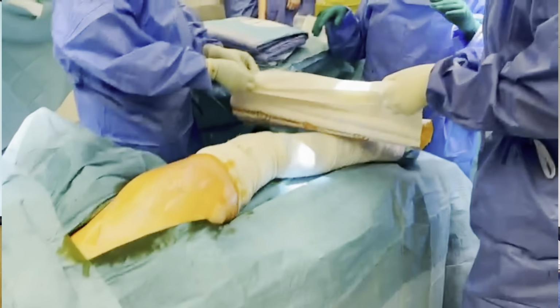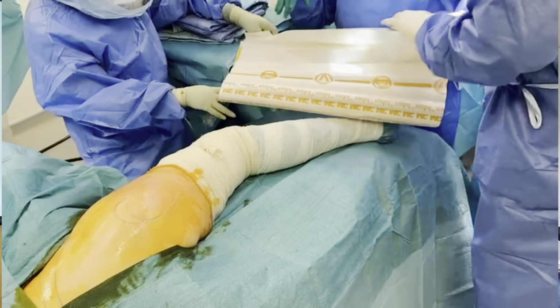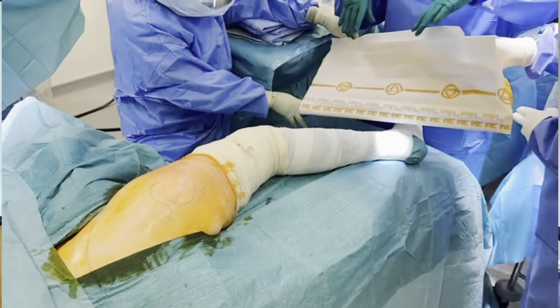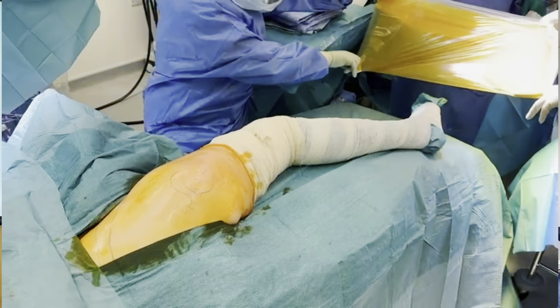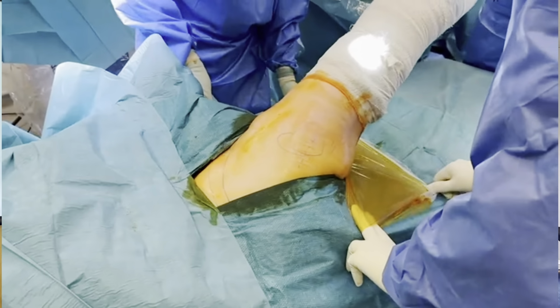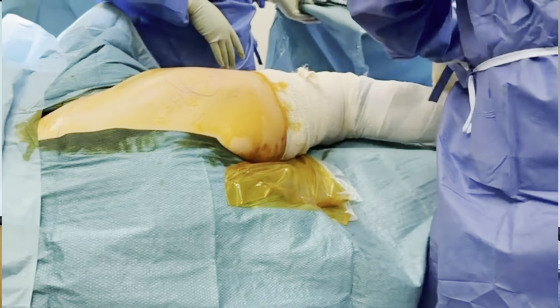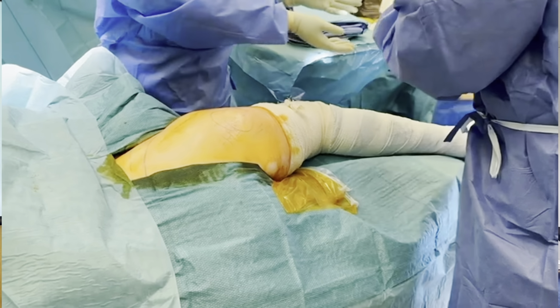So this is our hip draping, pretty standard, you'll see it. The important thing to note here is at the top of the hip, we've left space for where the pins go in. So we use two drapes. We use one underneath the hip, which is positioned on there. So some of you will drape like this, but the most important thing is that you need space at the top where you've marked the iliac crest and where the pins are going to go in. And then we put another drape on top of this.